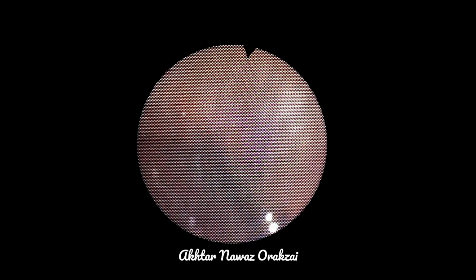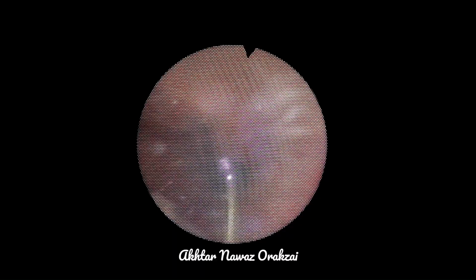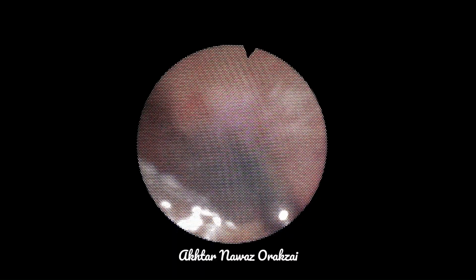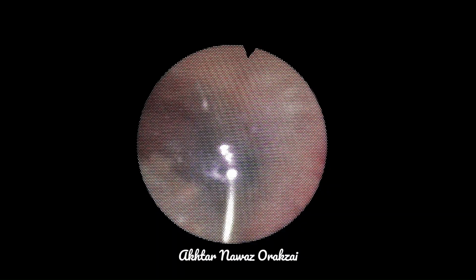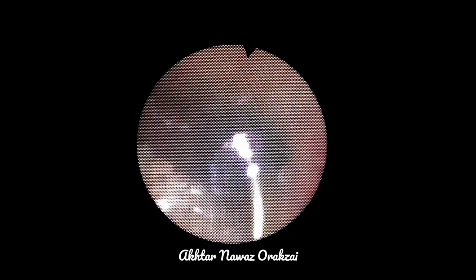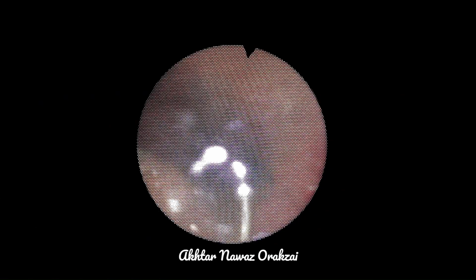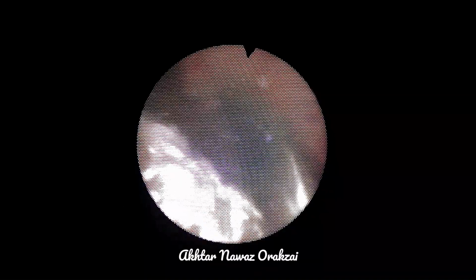Once we are through with all the dilators available, be that 26 FR or 28 FR, then we can place the Amplatz sheath, and a standard nephroscope will then be used suprapubically to do the cystoscopy, and then fragment the stone with the pneumatic lithoclast, and then retrieve the pieces.